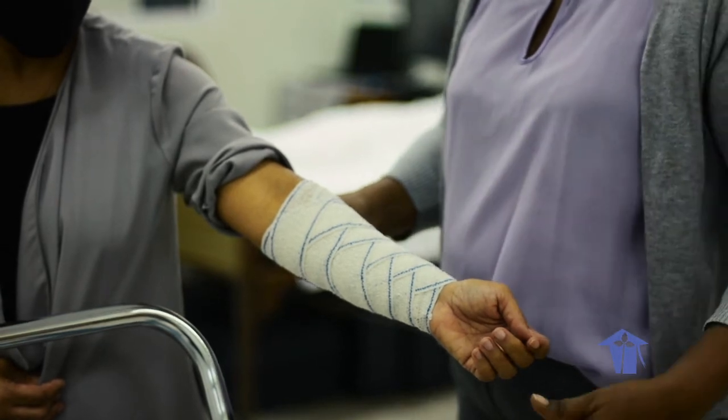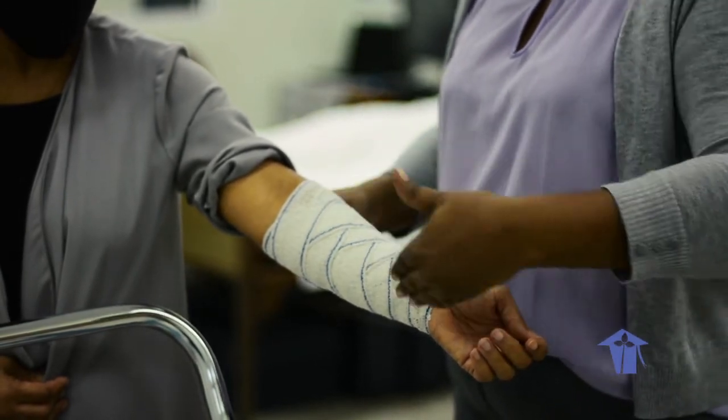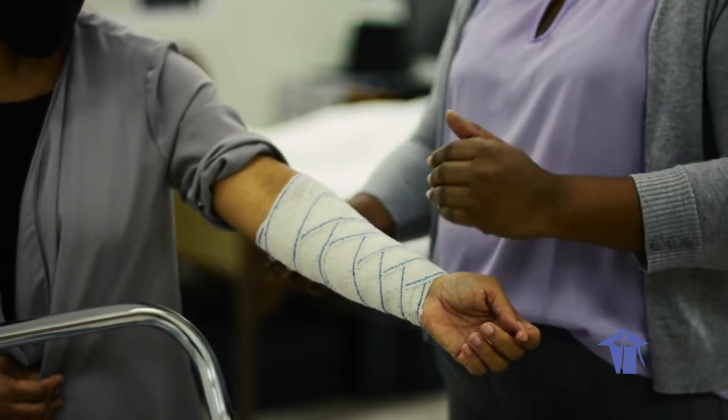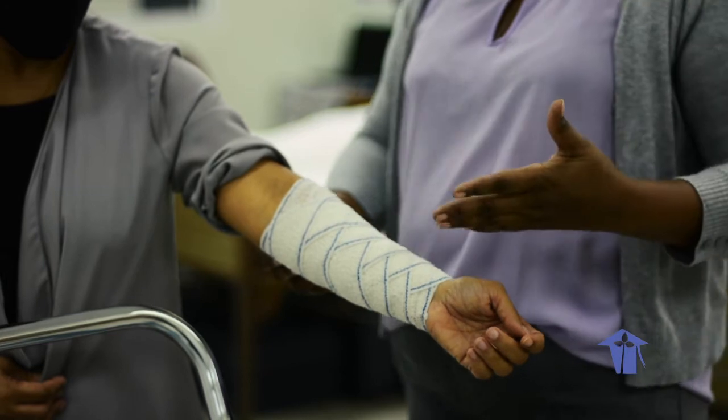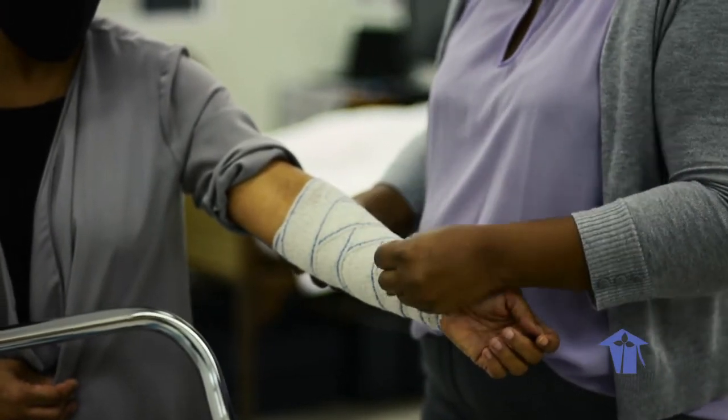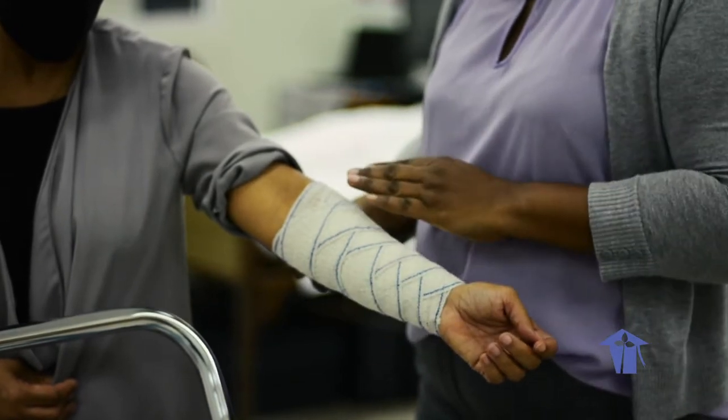You can place the figure-8 pattern on the inner aspect, the outer aspect, or the lateral aspect of the limb depending on where you need it. Keep in mind that wherever you put more folds and turns, that is where most of the pressure from your bandage will be concentrated.